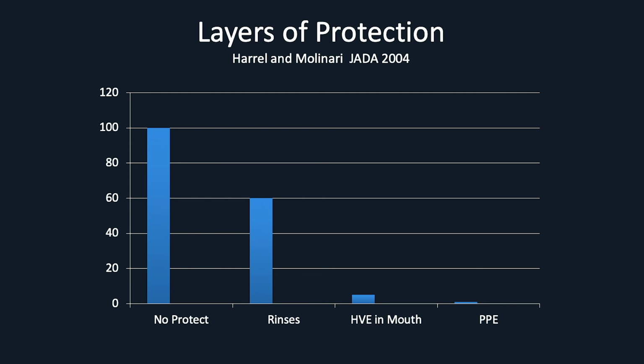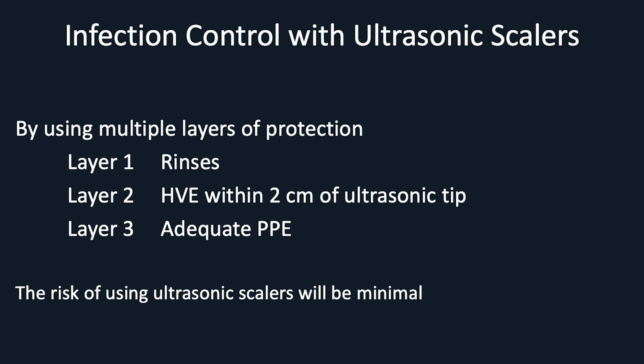Then we use the protective device, mask, etc., to protect us from this greatly reduced volume of aerosol. We're not working against the high volume they walked in with. We've reduced it to a very low level.